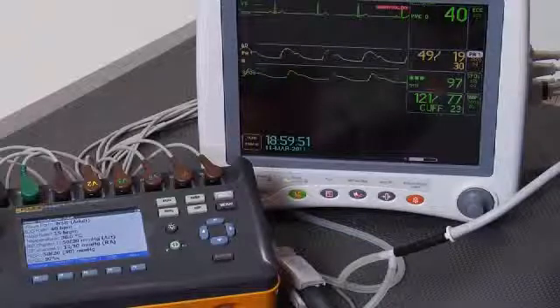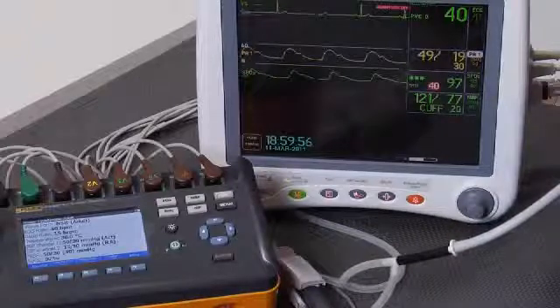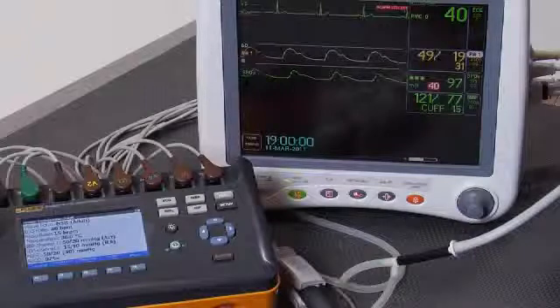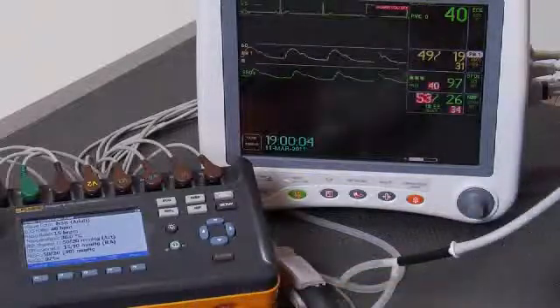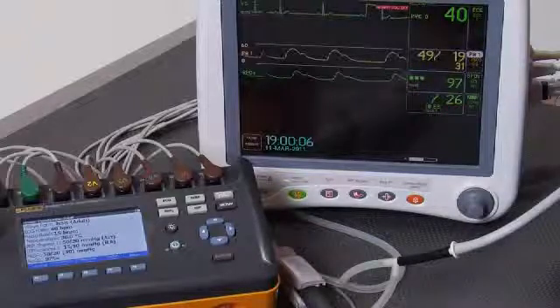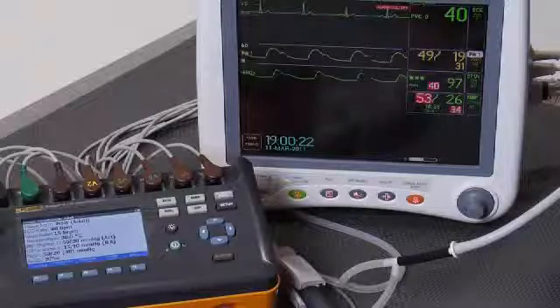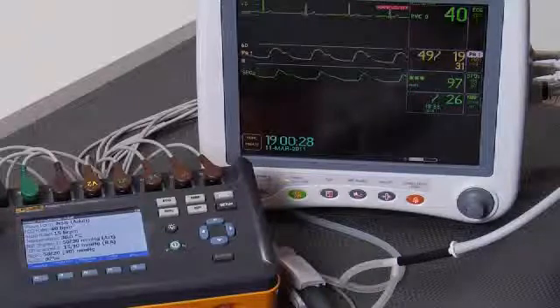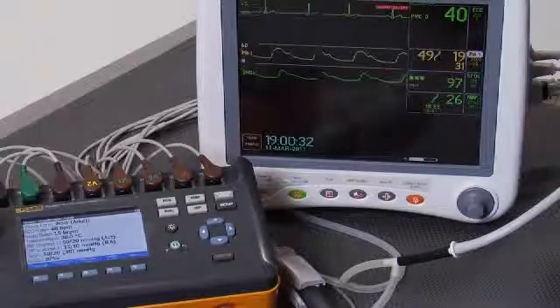We started at 18:55 and 44 or 45 seconds, and we're going to finish very shortly here. Done. And we have good values. As you can see, it is possible to do a complete, quick assessment of patient monitor performance using ProSIM 8 and front panel controls in under five minutes.